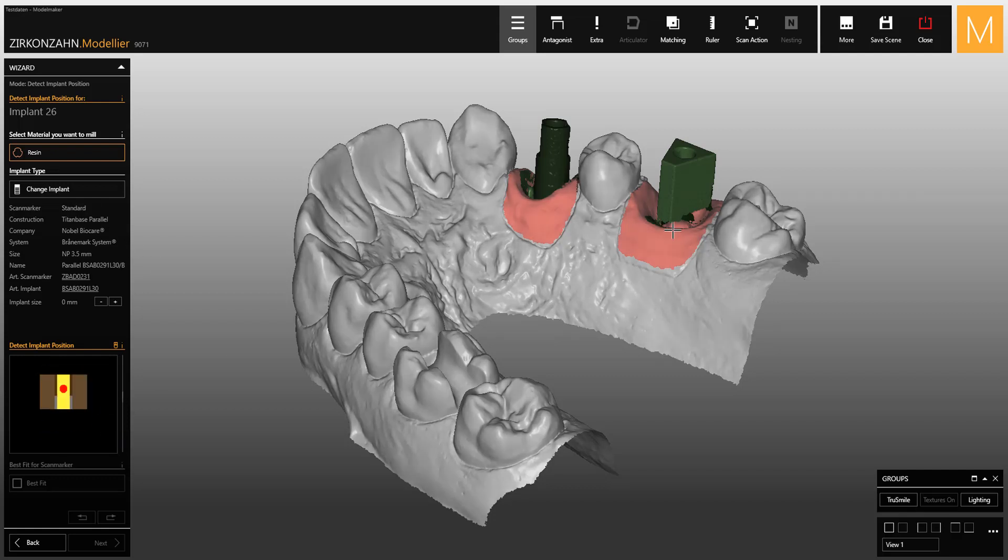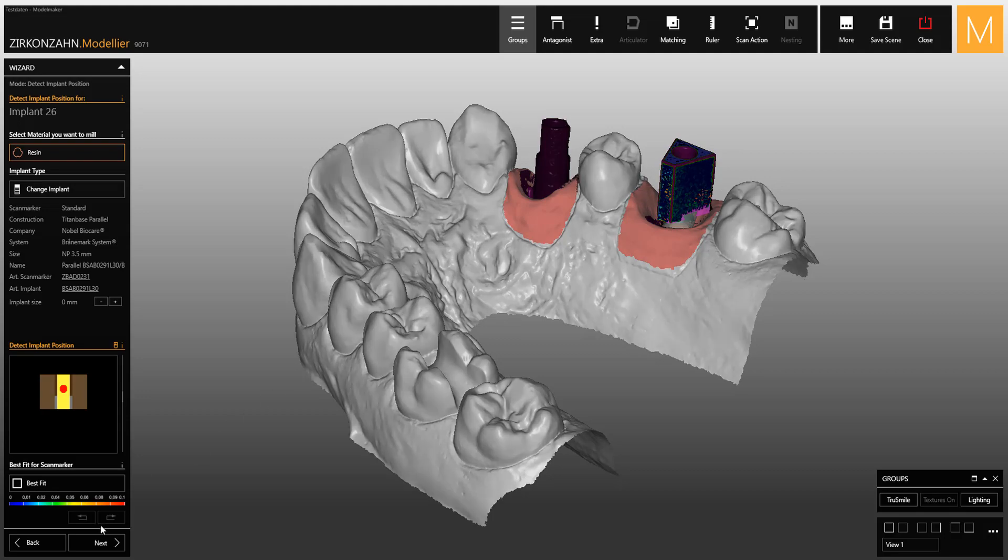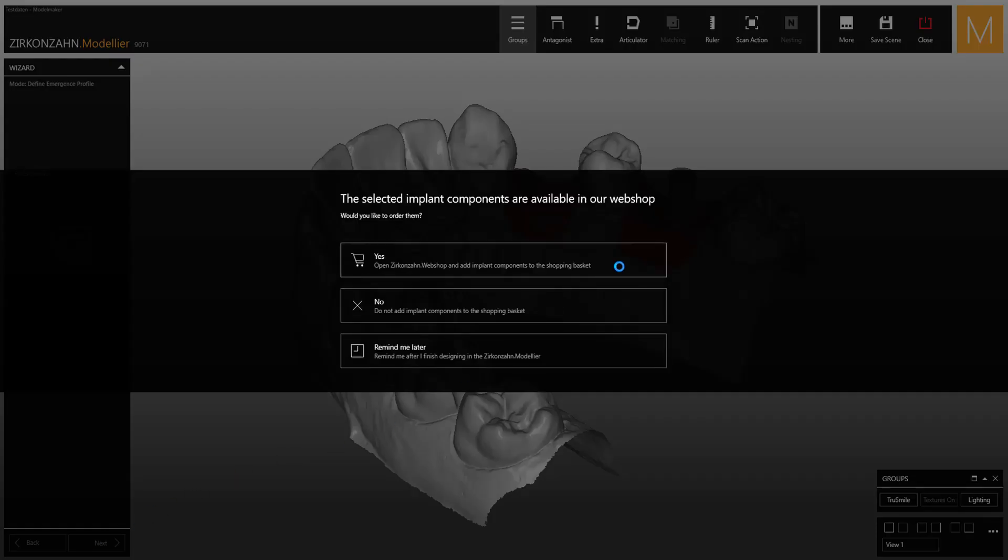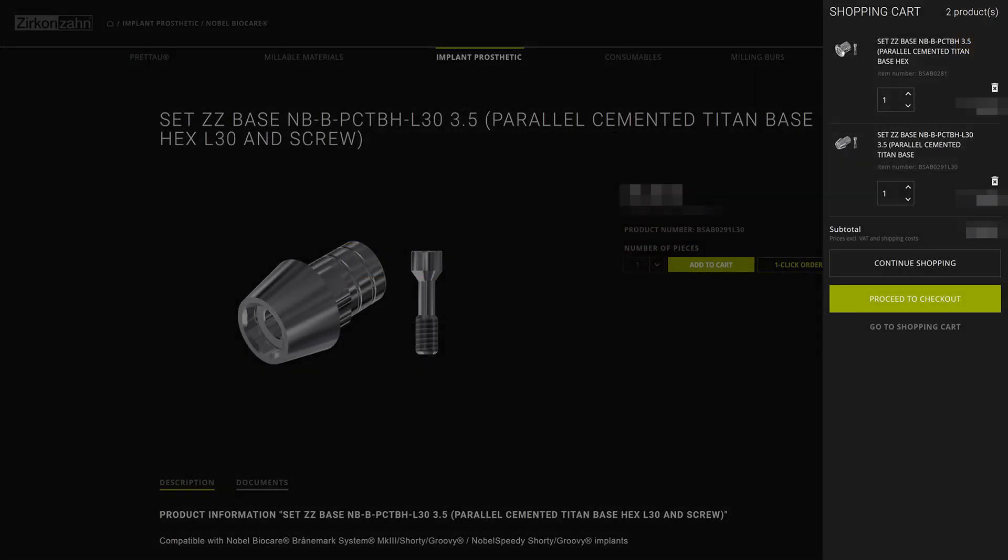Once done, click on Next and you have the possibility to directly order the chosen components via the ZirconZen webshop.